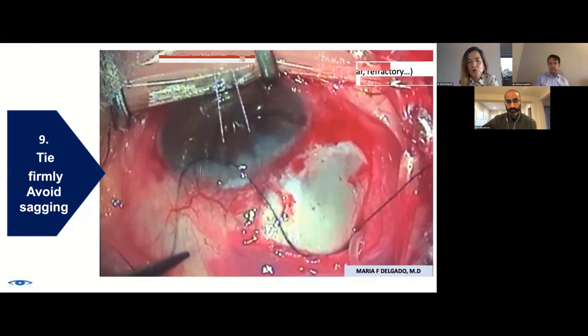Okay. I know Nate doesn't really use suture. We'll get to that a little bit later. But for me, I use 7-0 Vicryl. I do that because it's the same suture that I use for the corneal bridle suture, and it's more efficient for us to just keep using it. In some cases, we can get away with just using one double arm 7-0 for the majority of the case. And then we can use that for closing the conjunctiva as well, which we'll get to.